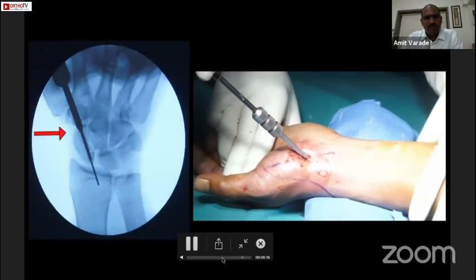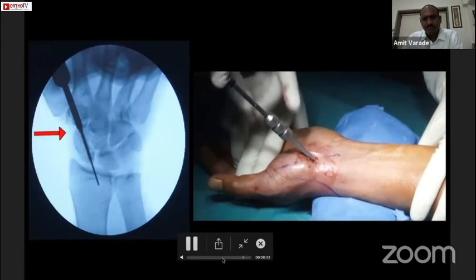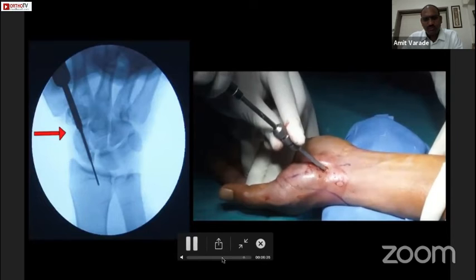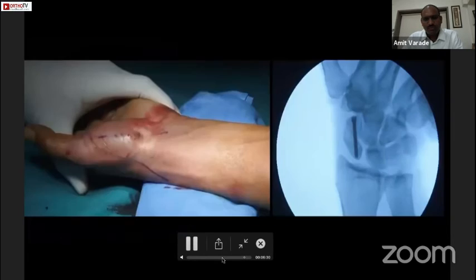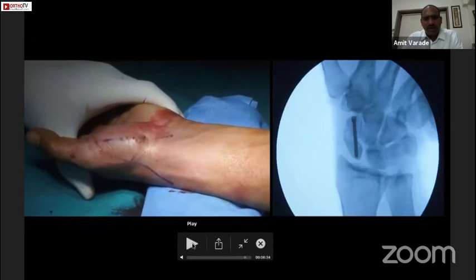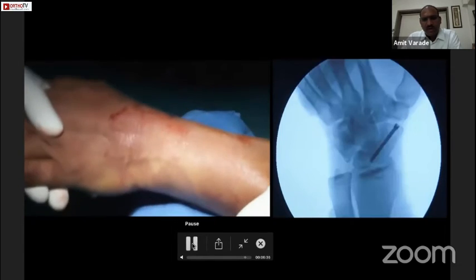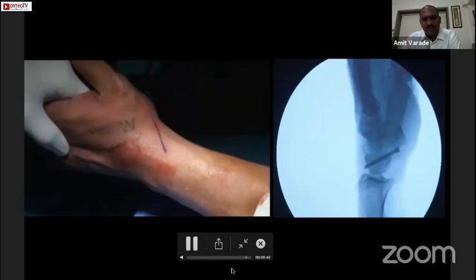After this, we gently remove the screwdriver and the guide wire. Then we confirm the screw position in all views again before finishing the surgery — the AP view, the pronated oblique view, and the lateral view. The screw is very well inside.